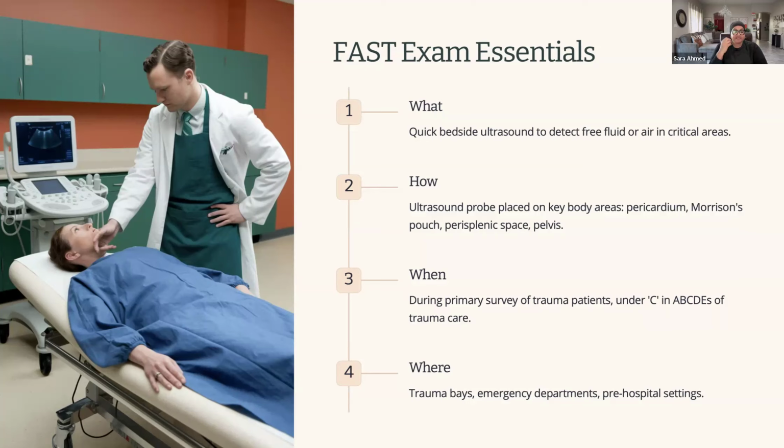Finally, why is the FAST exam so important? Clinically, it's a life-saving tool that allows you to prioritize interventions for rapidly fatal injuries like tamponade or hemoperitoneum. But on Step 3, it's a high-yield topic because it tests your ability to think critically and quickly in trauma scenarios. For example, a Step 3 question might describe a trauma patient with hypotension and tachycardia after a car accident.